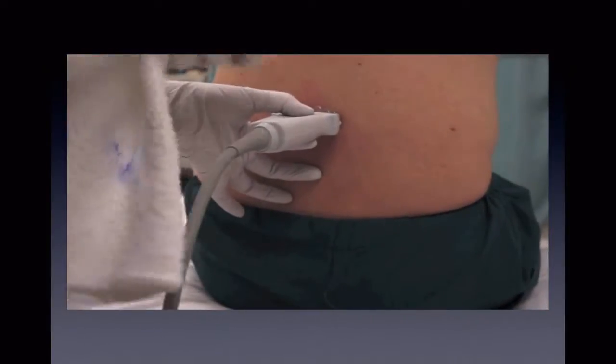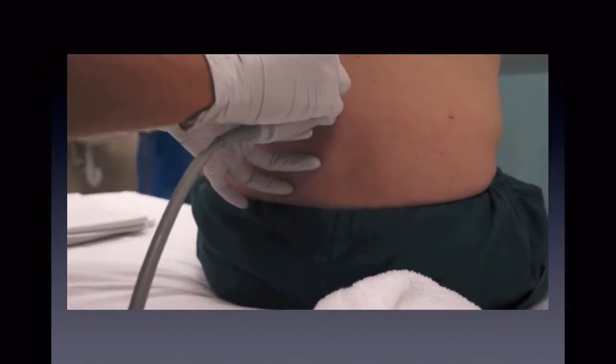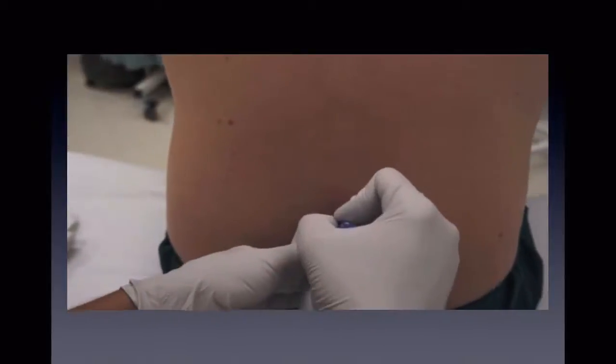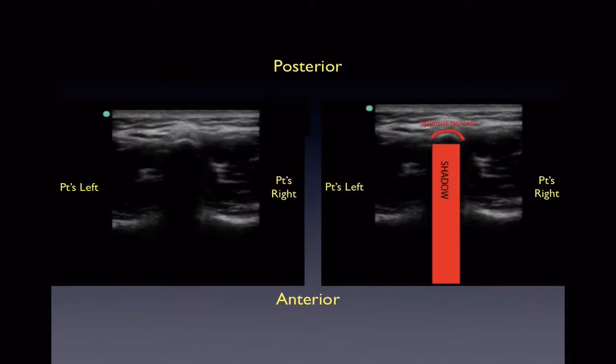Once you see this, you can mark the skin above and below the middle of your probe. You may need to wipe off excess gel in order for the marker to mark the skin. Again, we see the dome-like hyperechoic line that is the spinous process with posterior shadowing — this marks the midline of the back. The two images are the same; however, on the right we have it marked for easier identification.